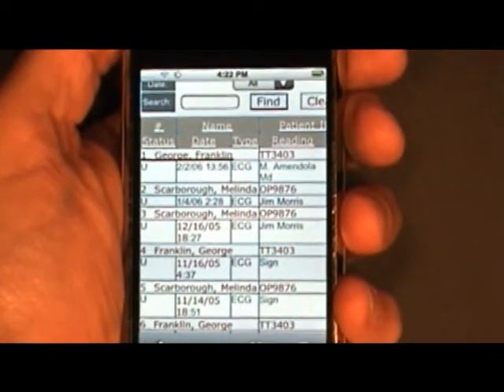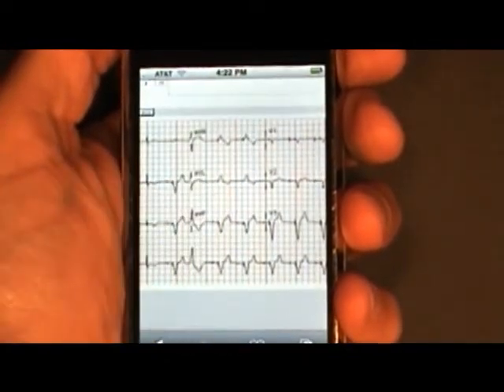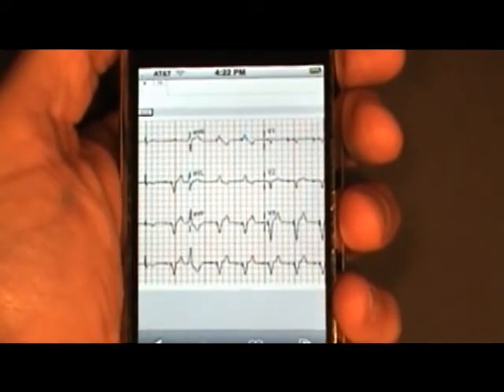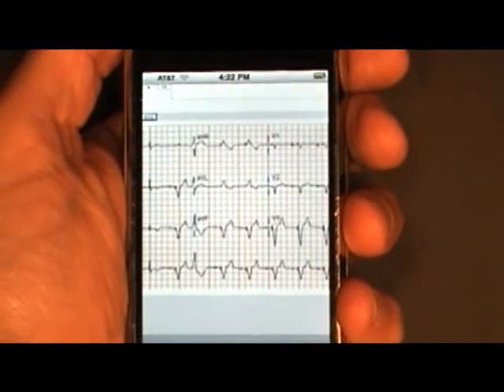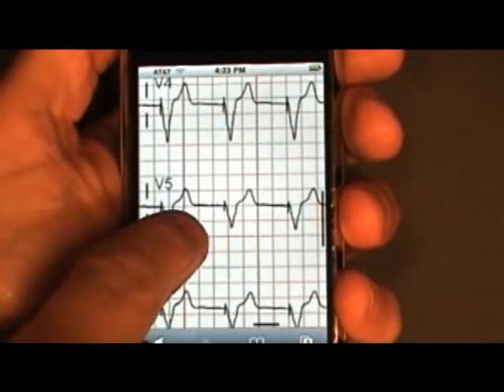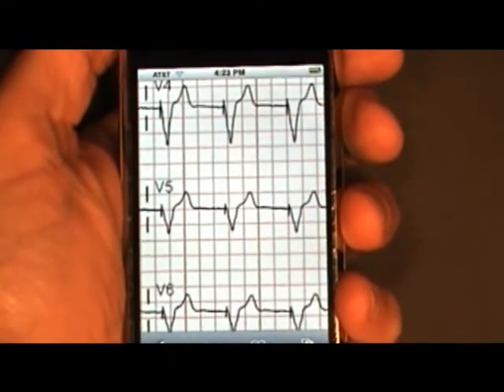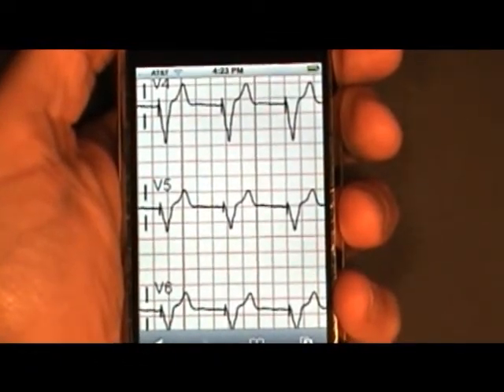Now, once the iPhone loads the study, you'll need to go ahead and scroll to the right, and there you go. A nice feature of the Apple iPhone is it gives you the ability to zoom in. And because we store our waveforms as vector PDFs, you'll have that nice, clean, crisp waveform.